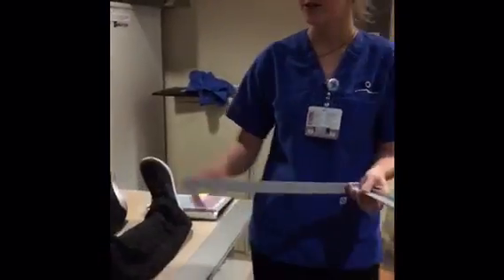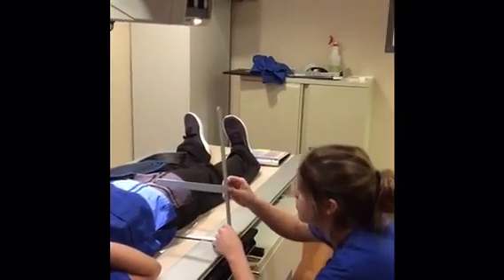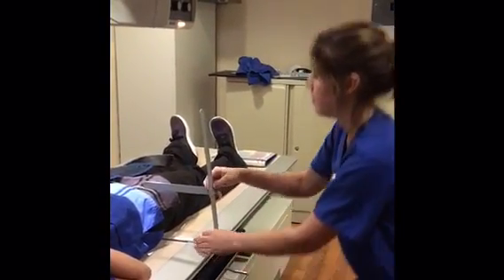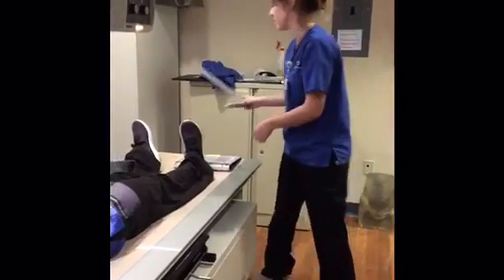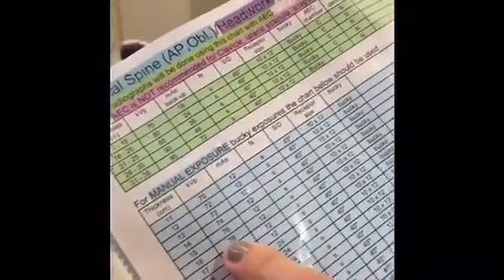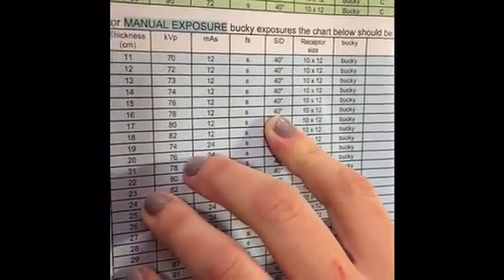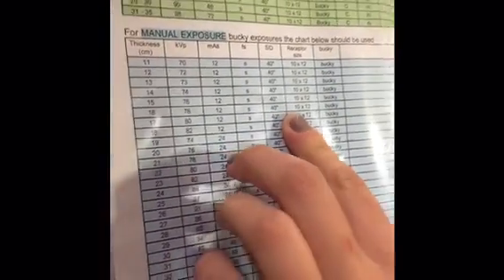After I rotate my patient, I will come and measure the thickness so I can decide my control factors. My patient measures 16 centimeters, so I will look at our factor chart. Since she is 16 centimeters, I will do a 78 kVp at 12 mAs with a small focal spot for bony detail, 40-inch SID with the 10 by 12 receptor size.